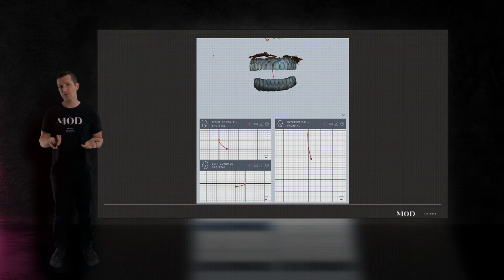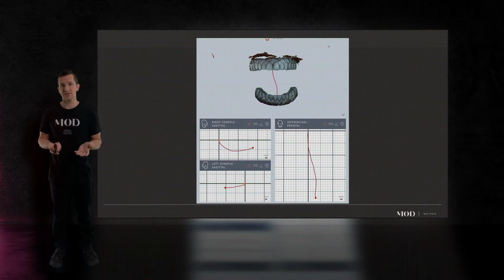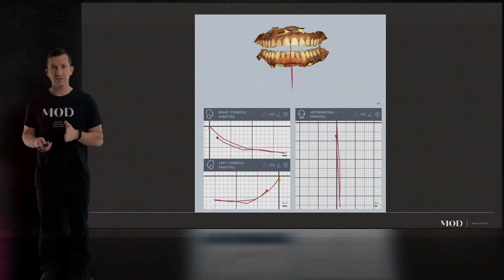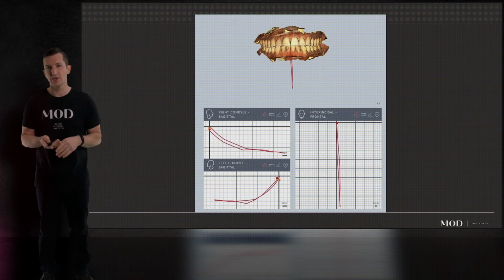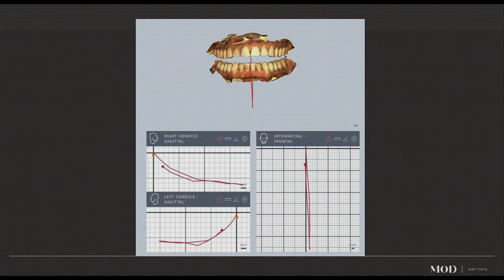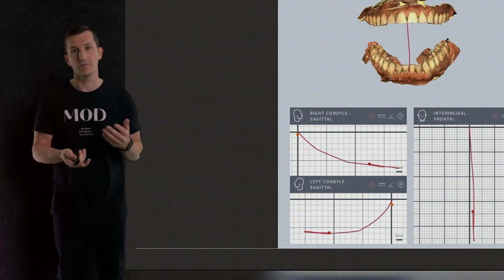When you look at that skewed opening, if you're assessing movement, you're certainly going to be able to see that visually. It's very obvious that that movement is sideways skewed. But sometimes it's not, like in this patient. If you're looking at this just visually, it's going to be very difficult to see this slight bit of skew and this kind of jump over on the closing stroke. But when you look at it graphically, it becomes very obvious. And so these are truly valuable information for us in assessing the health of our patient's temporomandibular joint.